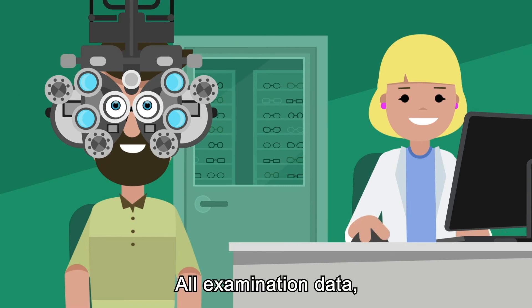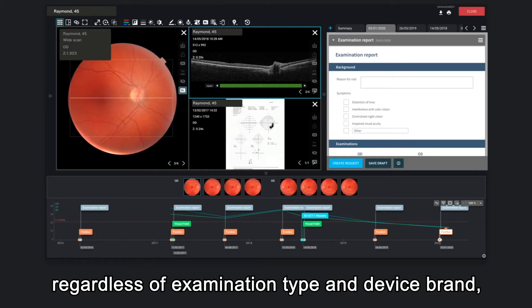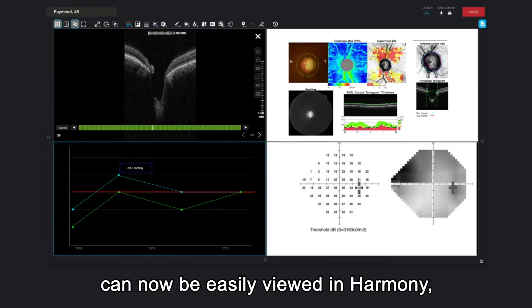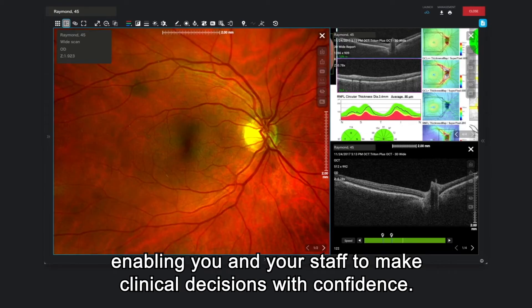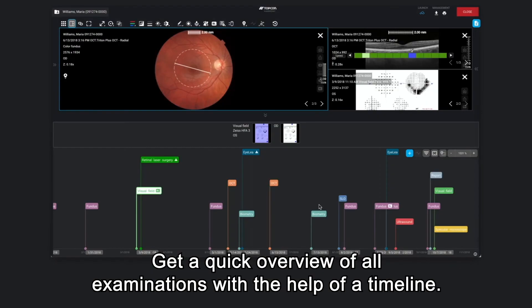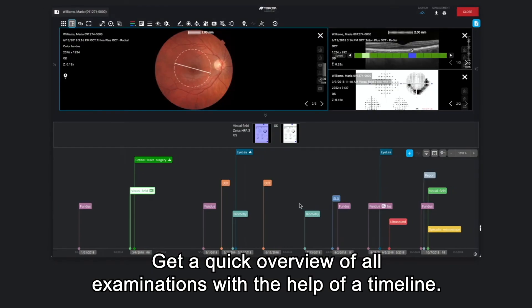All examination data, regardless of examination type and device brand, can now be easily viewed in Harmony, enabling you and your staff to make clinical decisions with confidence. Get a quick overview of all examinations with the help of a timeline.